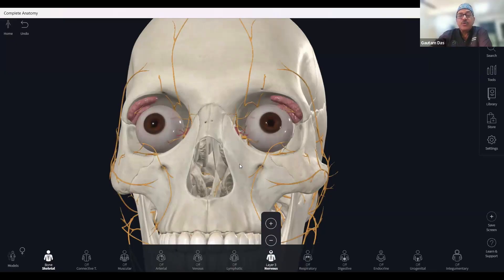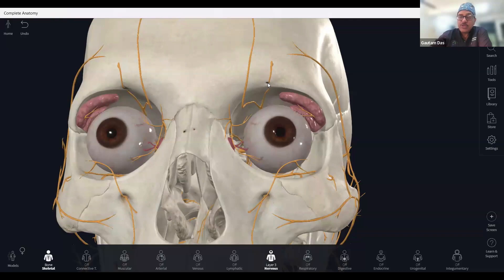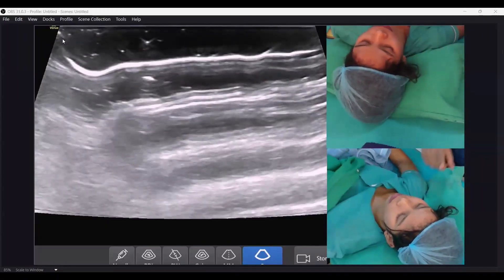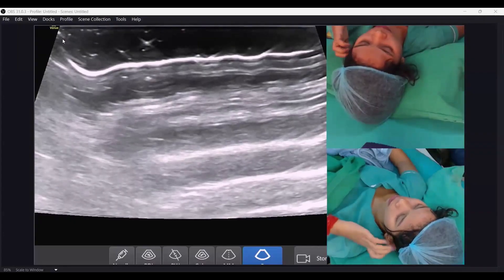For the supraorbital, what you can do is put the probe over the eyebrow and then come down towards the eye. Once you see there is a break in the bone, that means that is the foramen. You can sometimes get pulses and sometimes they may not be visible. But once you are seeing this foramen, put your probe there. So I will be putting my probe over the eyebrow and just searching for the break in the bone — that break in the bone will be your supraorbital foramen through which the nerve is coming out.